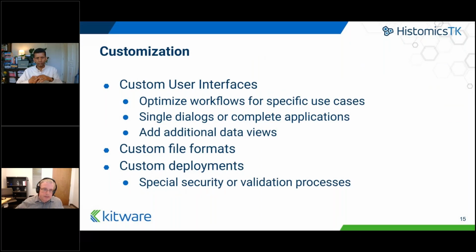Everything's customizable. So we can customize user interfaces. I'll go through some examples of this. You can customize this either like a dialog that just pops up some additional data, or it can be a complete application, which is a totally different format using the same API under the hood. We can have additional data views. So you can embed this in the data browsing pages, or you can have this in the Histomics UI as a panel of additional data.